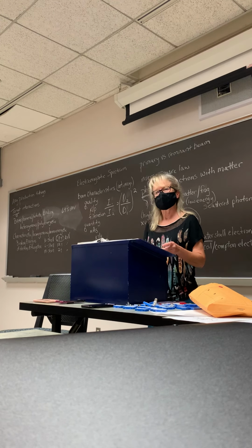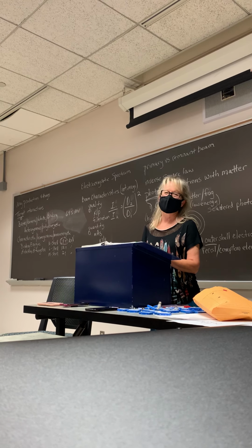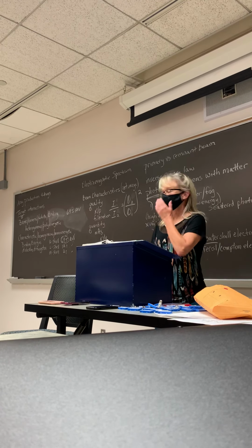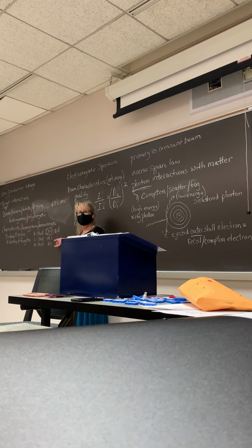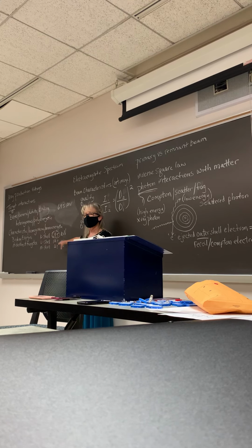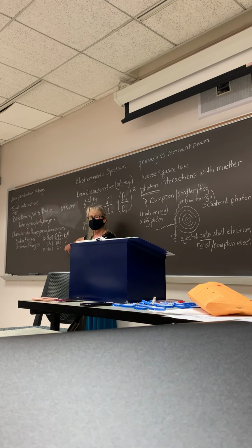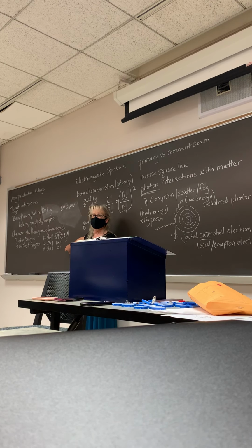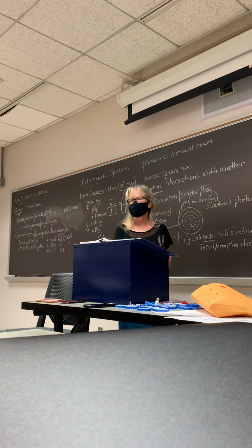Do you have to do a math problem like that? No, I won't ask you to do that, I just wanted to show you the numbers so you understood it. But you need to know at least 70 kVp is needed to produce characteristic. Brems are created from 1 to 150 kVp.